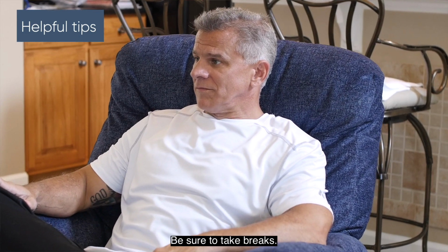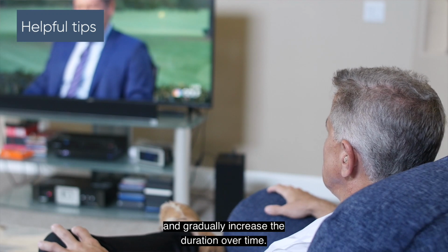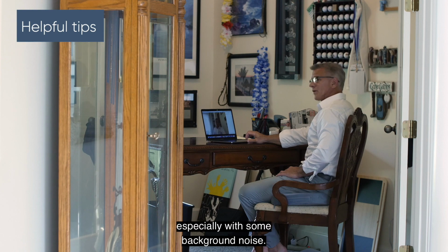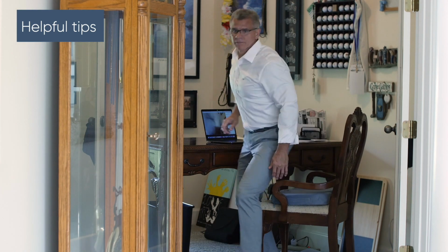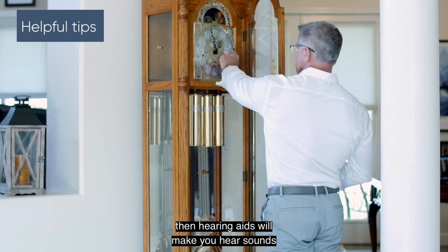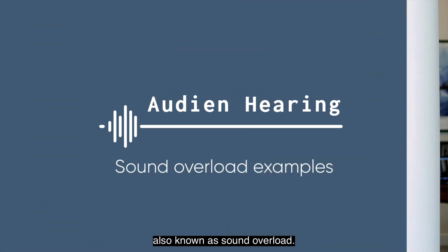Be sure to take breaks. Use your hearing aids for a few hours each day and gradually increase the duration over time. Anticipate some frustration, especially with some background noise. If your hearing loss has been bad for a few years, then hearing aids will make you hear sounds you haven't heard in a long time, also known as sound overload.